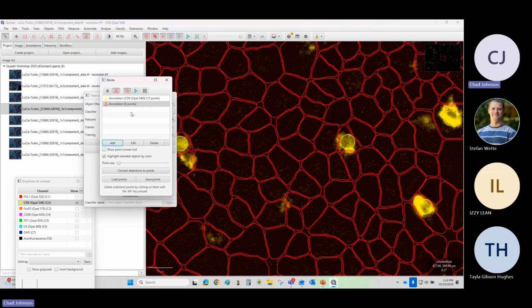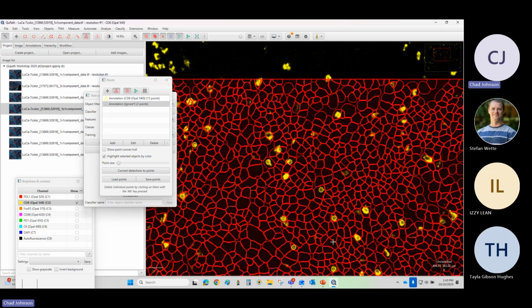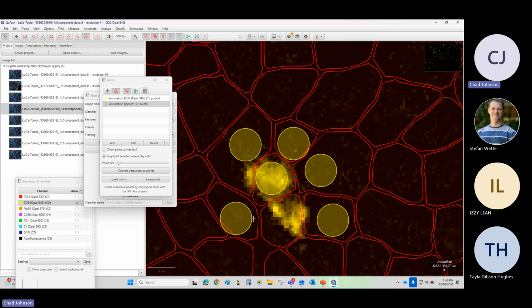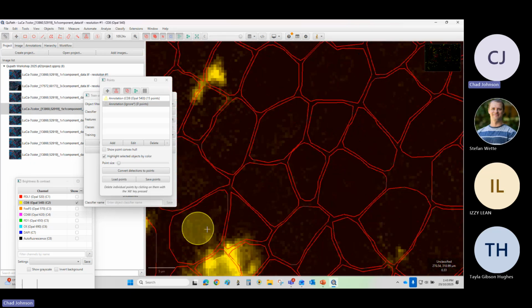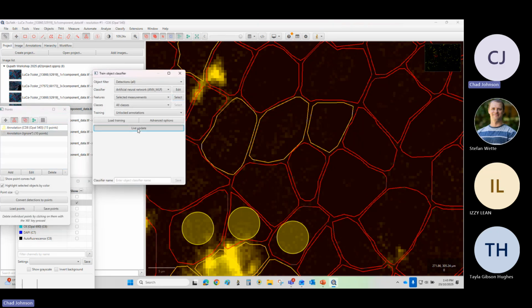I'm going to add another one, which is my ignore class. I'm going to tell it what to ignore. Now that's probably negative. It's possibly positive, but I'm going to treat that as negative. It's always a good idea to have negative channel around the cells that are positive, because you get some overflow from the positive cells. Now that I have actually done two separate channels, I can now start my live update.